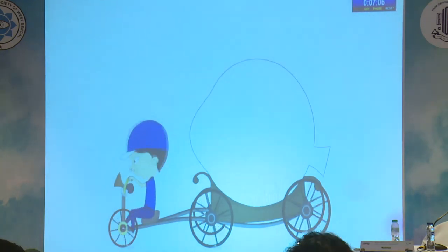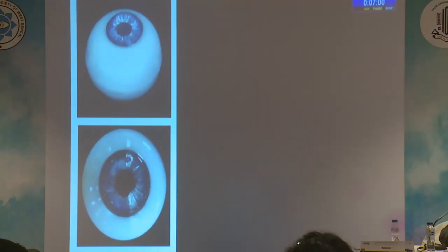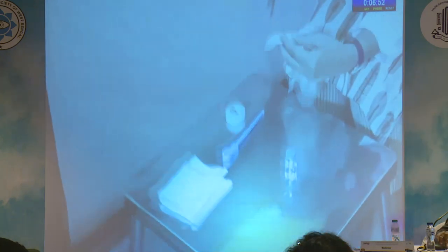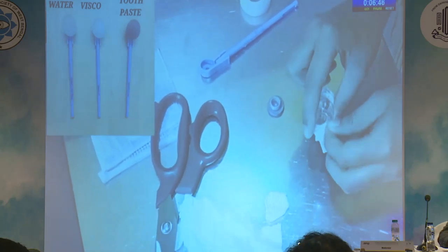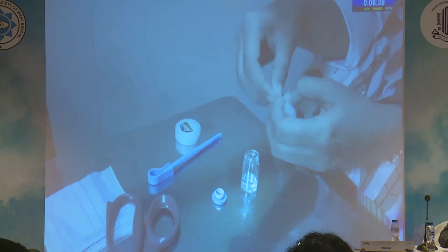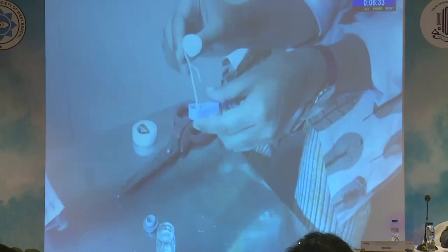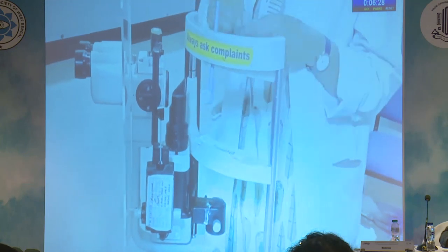First, we had to create an alternative to goat or human eyeballs for wet lab practice. We thought of silicone eyeballs. They are a good, reusable option, but a bit costly and difficult to find and maintain. So we thought of making our own practice eyeball. We took a pair of gloves, cut out the fingers, and filled one finger with water. Another with leftover viscoelastic, and the third with toothpaste. We tied them up with an elastic band of used masks. Then we mounted it on a used keratome with its cover and used its handle to hang the eyeball on the slit lamp.